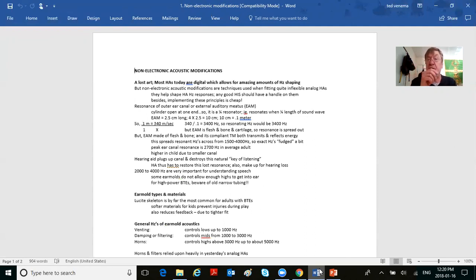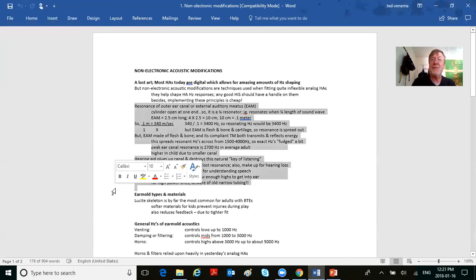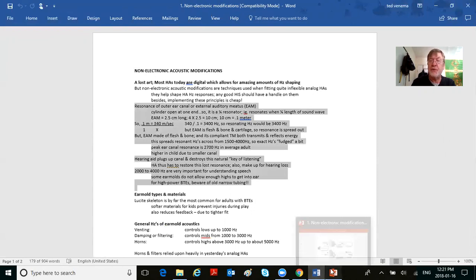Any good hearing instrument specialist should have a handle on them. Besides, implementing these principles is cheap. Well, there's three of them. Vents, filters, horns. Three non-electronic acoustic modifications, and the greatest of these is love. No, faith, hope, and love. The greatest of these is vents. Now look at the next paragraph. This is something you should make your friend. Okay? Because all of this is talking about what happens when you do this.